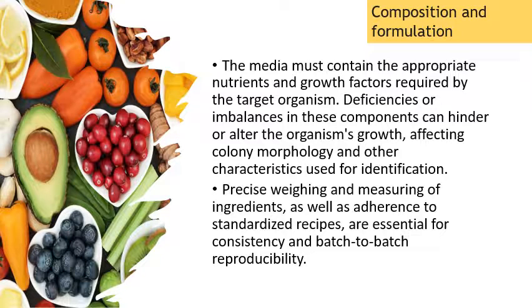Precise weighing and measurement of ingredients, following the standardized constituents to ingredients quantity, must be ensured to provide consistent growth of the target organism. If the constituent or composition of the formulation is below what is expected, this will be a requirement for another organism which can be in the environment. Hence, there will be a false growth of organism.